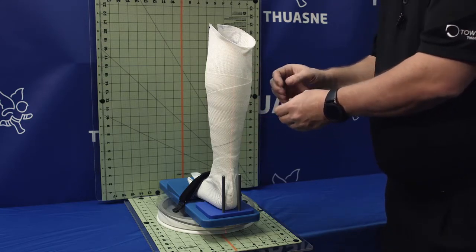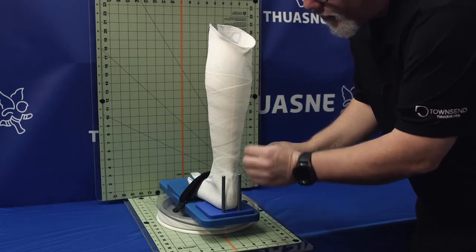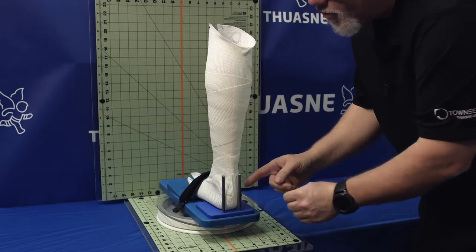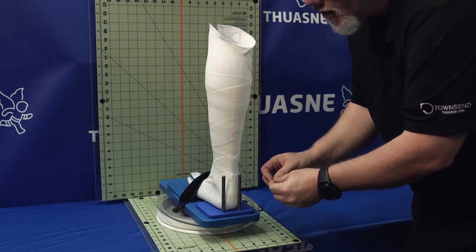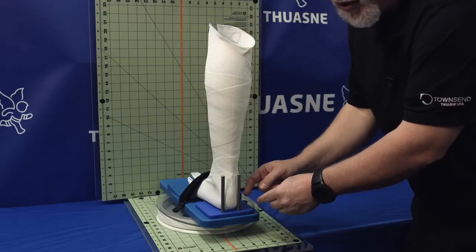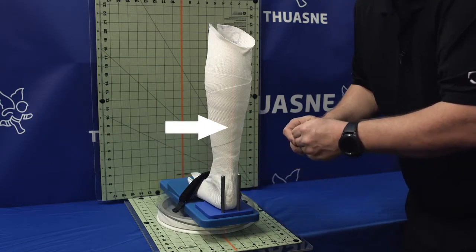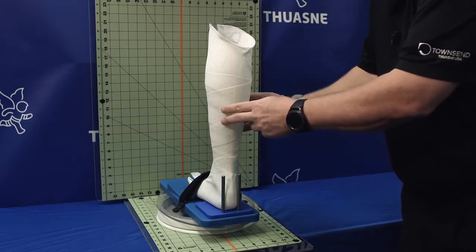The patient, when casted, should have had knee centered over ankle. And now we're checking coronal alignment of the hind foot, trying to determine if the patient's hind foot alignment is appropriate. As you can see, we do have total contact at the heel from medial border to lateral border, and the plumb line runs center up the Achilles tendon. So this is a properly aligned cast.